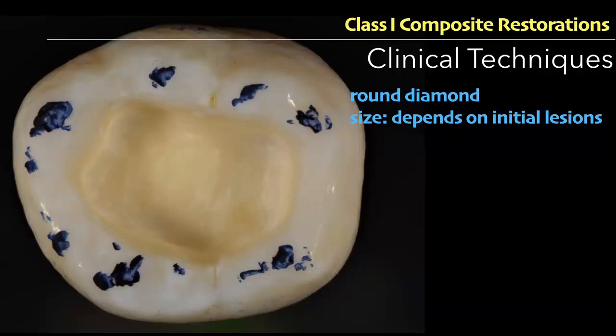Once you dry it, the dentine loses all its water, and that leads to sensitivity. The most frequent complaint of patients with composite is post-op sensitivity. So that's how we can manage this problem. We don't cut the tooth in dry situations. We always use air and water spray to cool the dentine so that water remains in its position.